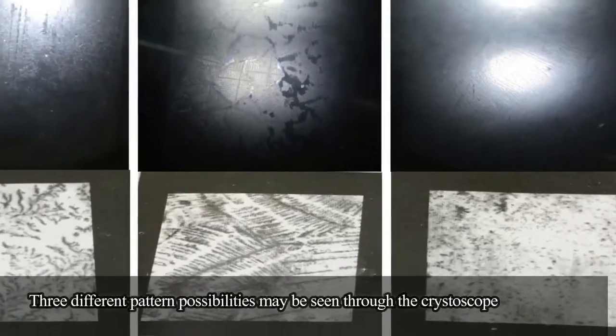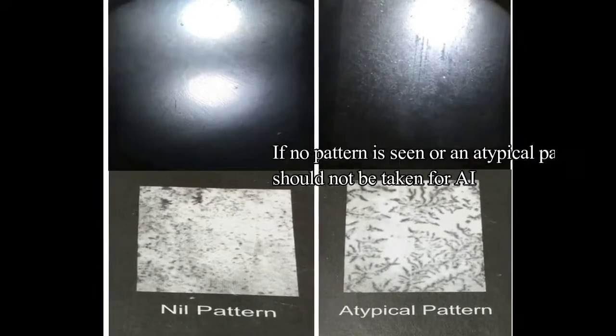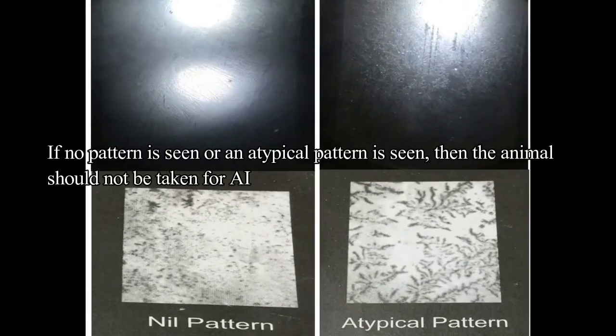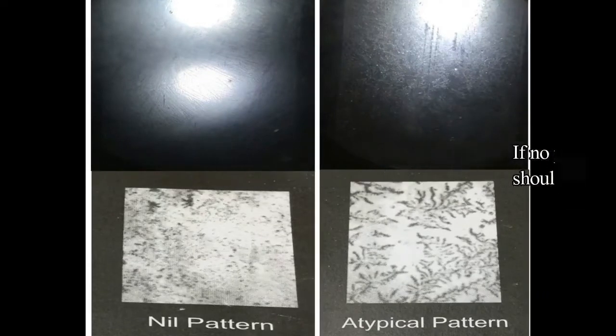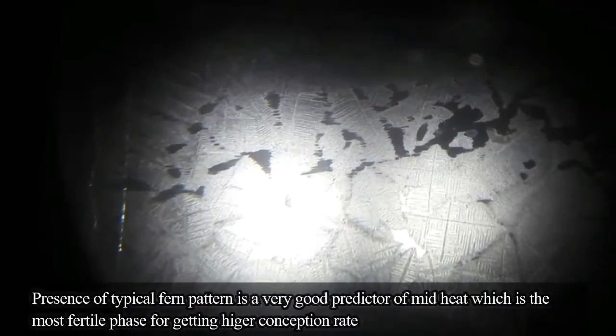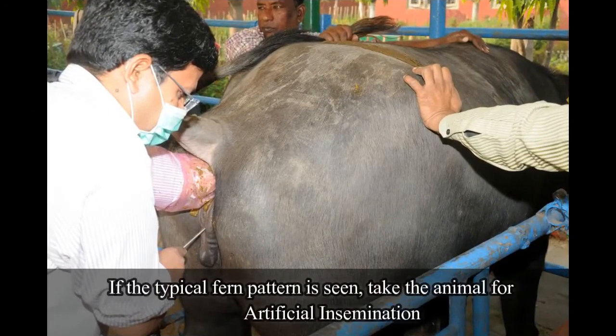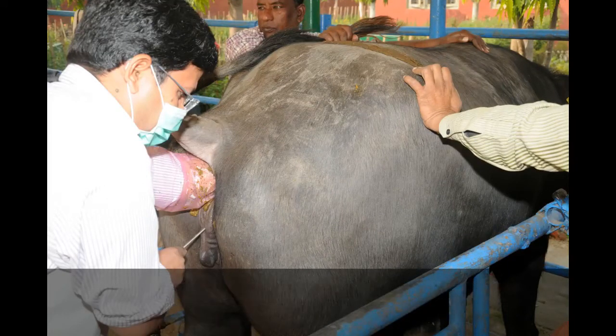Three different pattern possibilities may be seen through the CrystalScope. If no pattern is seen or an atypical pattern is seen, then the animal should not be taken for artificial insemination. Presence of a typical fern pattern is a very good predictor of mid-heat, which is the most fertile phase for getting higher conception rate. If the typical fern pattern is seen, take the animal immediately for artificial insemination.